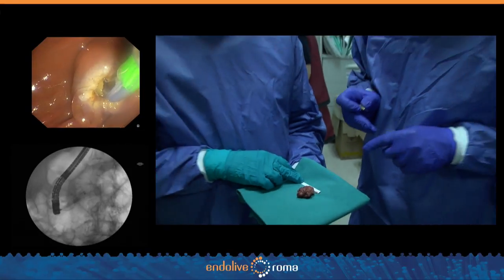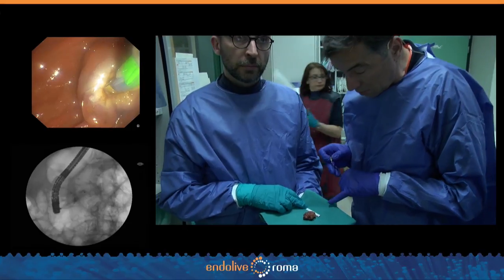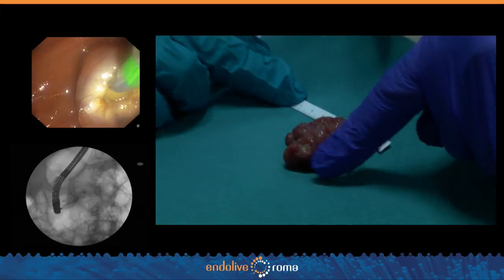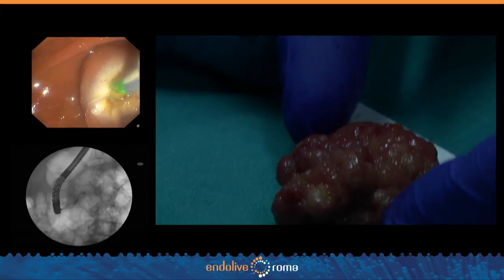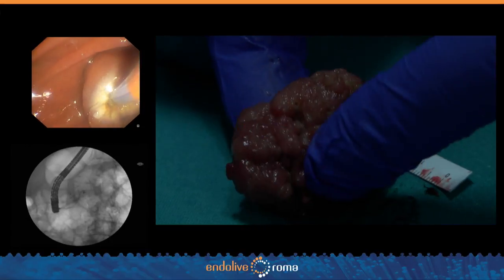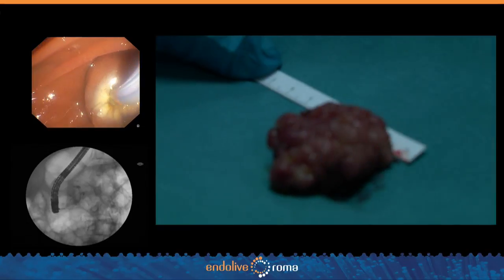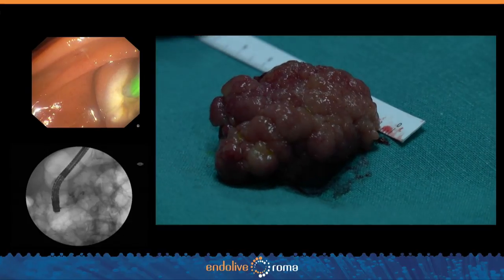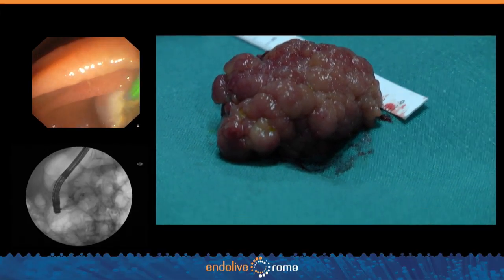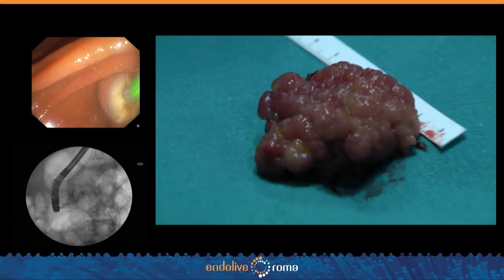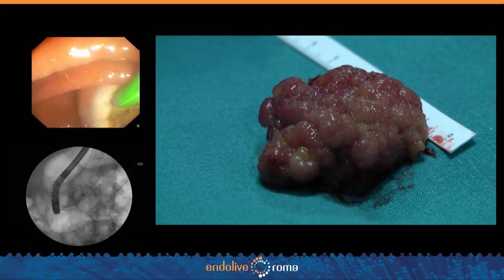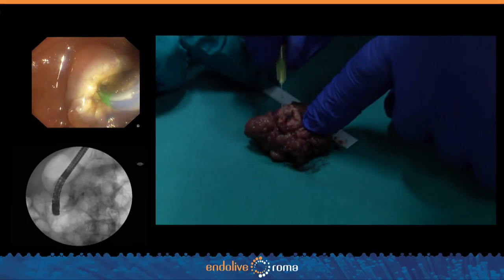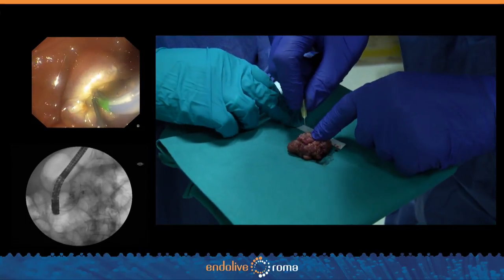You can see the lesion that was removed — it's almost four centimeters in size. Mark is spreading it out to show the ducts. Now going to the ERCP picture. We have cannulated the pancreatic orifice, which is nicely seen here. The tumor is completely gone. There is an angulation here, so we need to manipulate the guide wire.